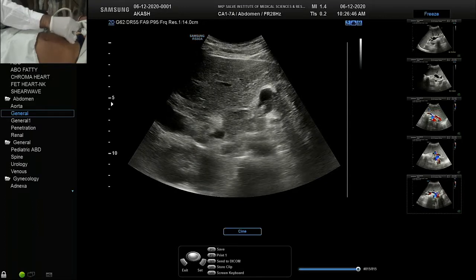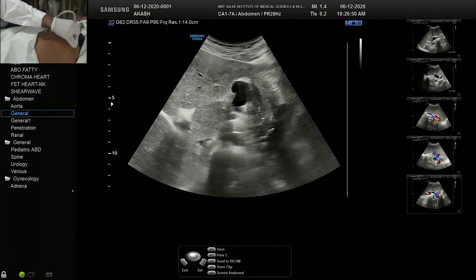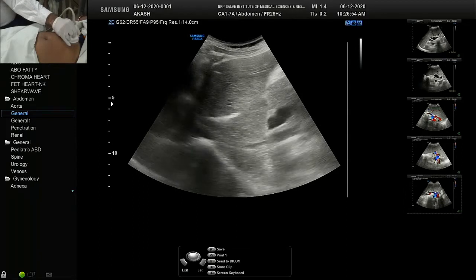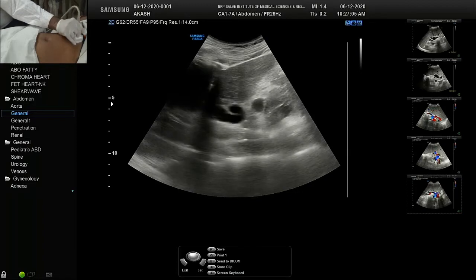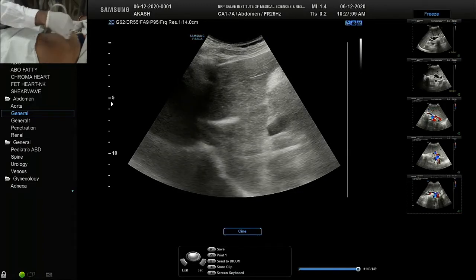They say you can measure it better on a CT scan, the caudate lobe to right lobe ratio. That is left lobe above. This is caudate lobe. There are measurements available about both dimensions of the caudate lobe, and we can diagnose hypertrophy of the caudate lobe accordingly.